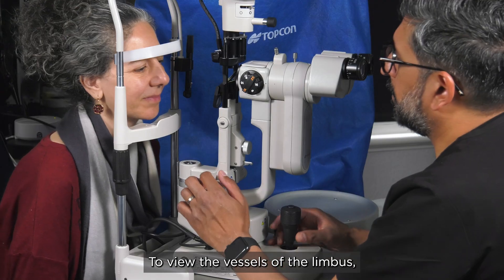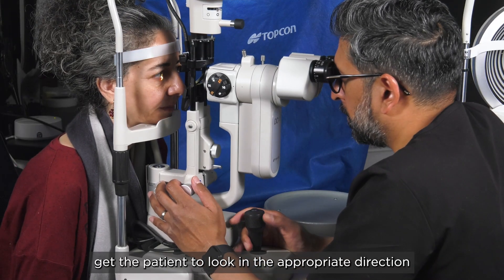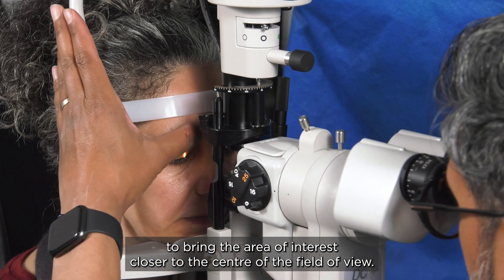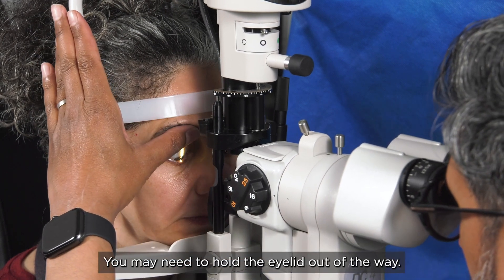To view the vessels at the limbus get the patient to look in the appropriate direction to bring the area of interest closer to the centre of the field of view. You may need to hold the eyelid out of the way.